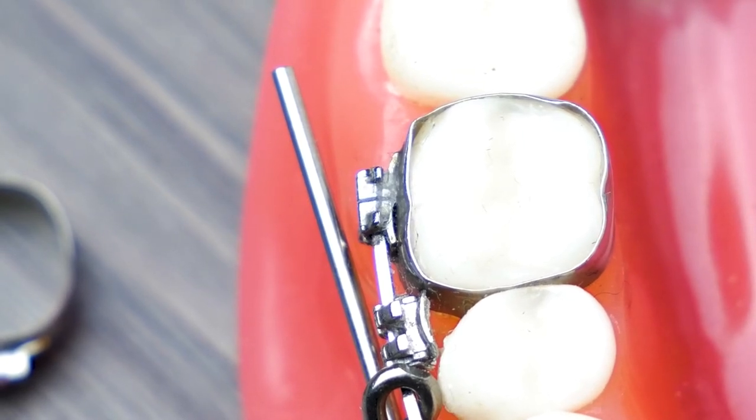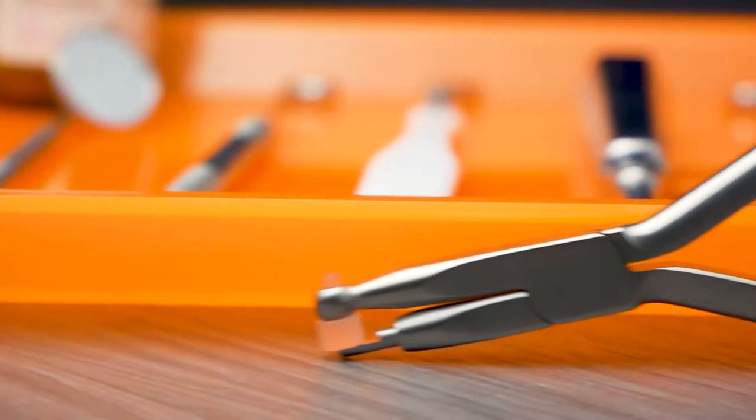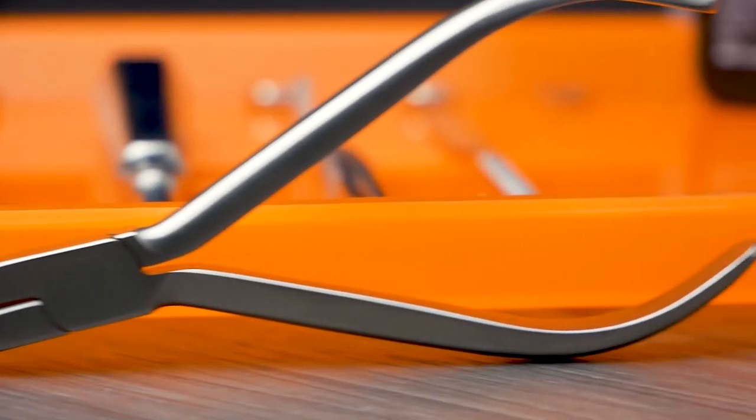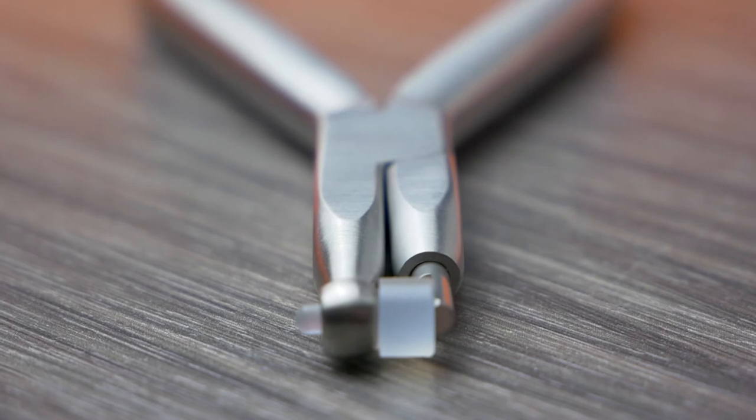If the band needs to be removed, the doctor will use band removing pliers. These are stainless steel pliers and have a beak designed for precision gripping.